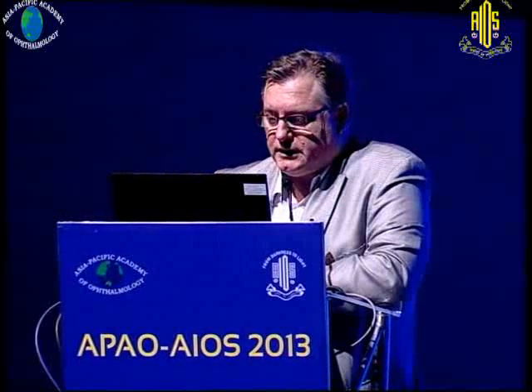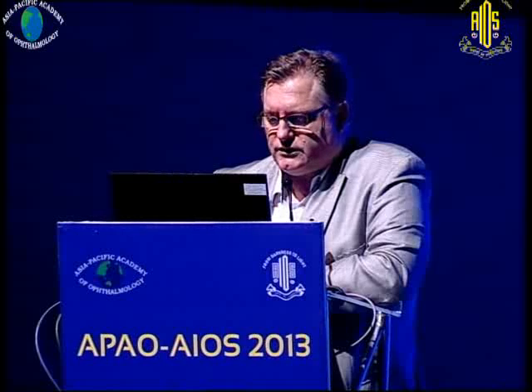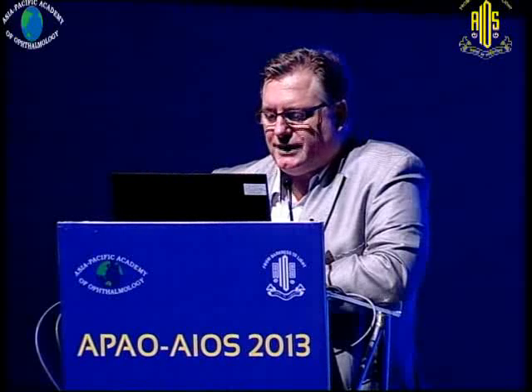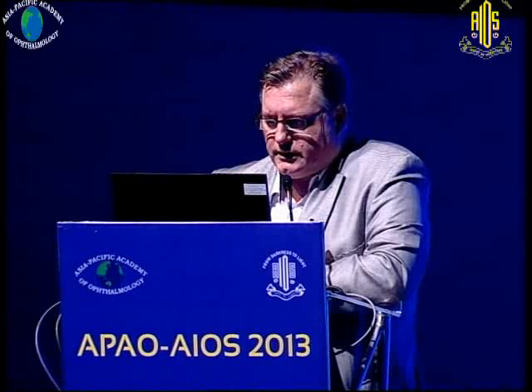The Rosenbaum reading charts testing showed a little bit of improvement, but this was due to the fact that the patient could read smaller print. The Pentacam showed the results here. A central steepening in the middle gives you the near acuity. Here in this case was an addition of 1.6 diopters. The Q value goes a little bit to asphericity, negative asphericity. We don't know if this has also a big impact on that. Stray light measurements were equal between preoperative and postoperative examination and didn't change over the 3 years. And the endothelial cell count also remained stable over 3 years follow-up. Let's go further.